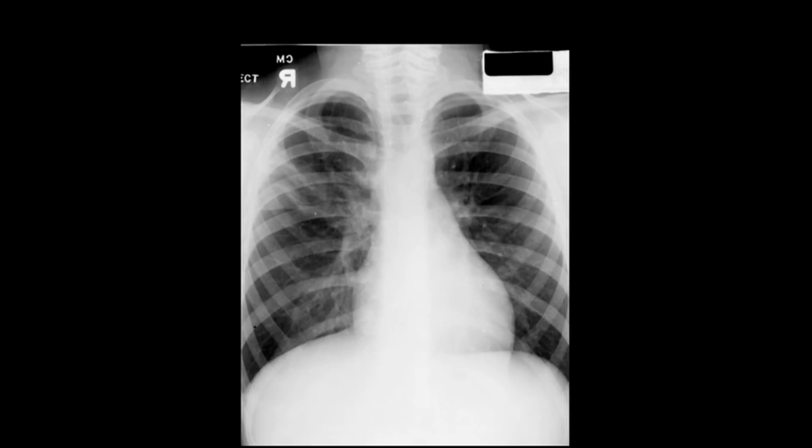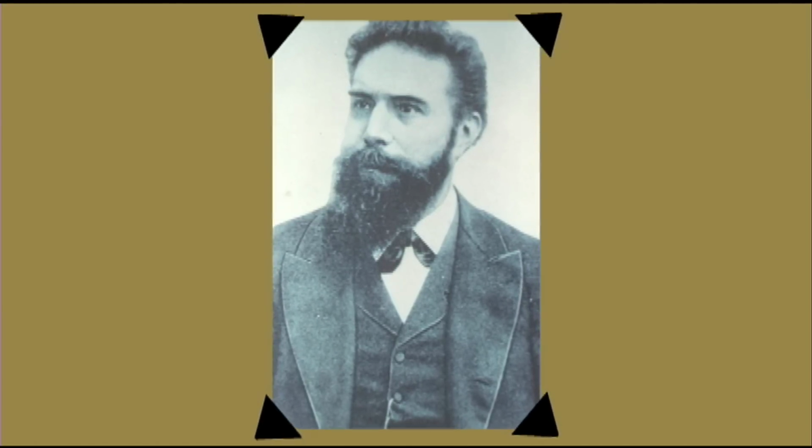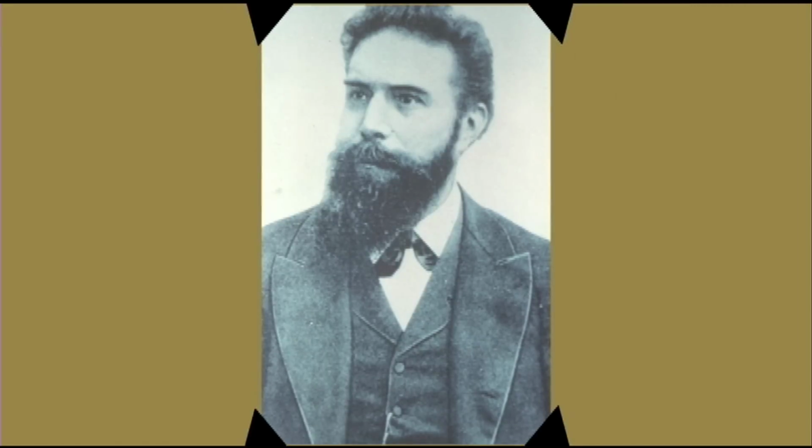The next dense object is fat, and fat has kind of a dark gray. After that, we have water or soft tissues, and those are listed together because water and soft tissue have about the same attenuation on a standard radiographic technique. Easy to tell those two apart on a CT scan, but not so easy on a standard radiographic image. After that, we have bone, and finally, metal, which shows up bright white because it blocks all of the X-rays passing through the body. By the end of the 19th century, Professor Röntgen's X-ray discovery 4 years earlier was a firmly established technique for medical diagnosis and treatment.